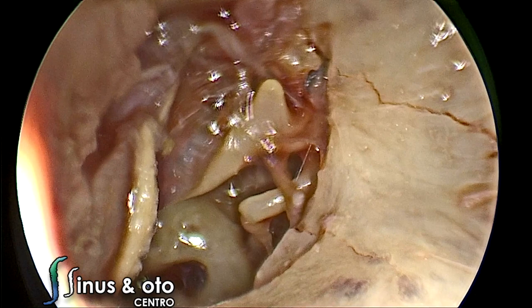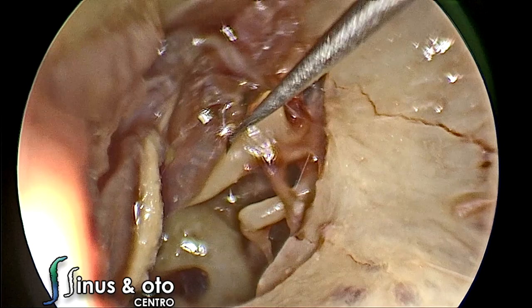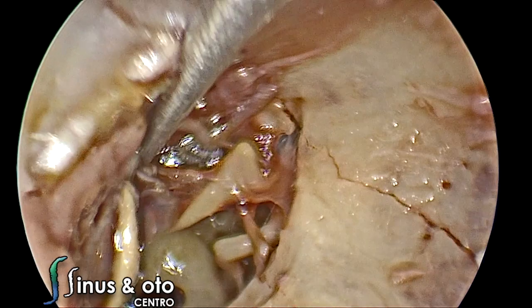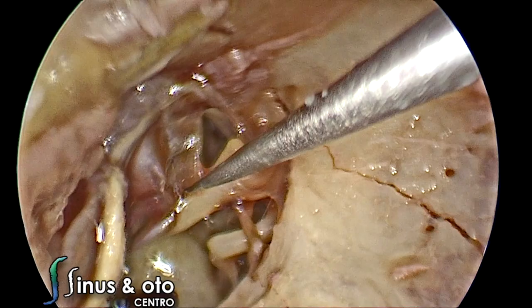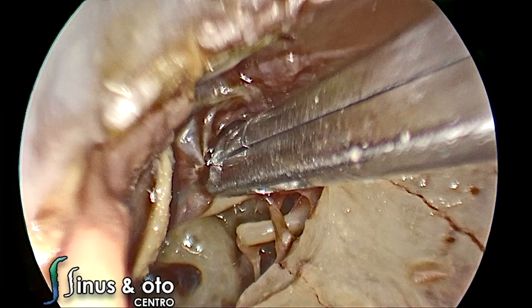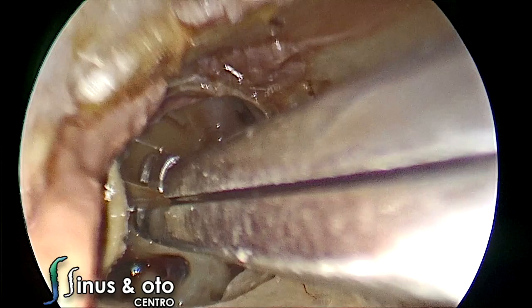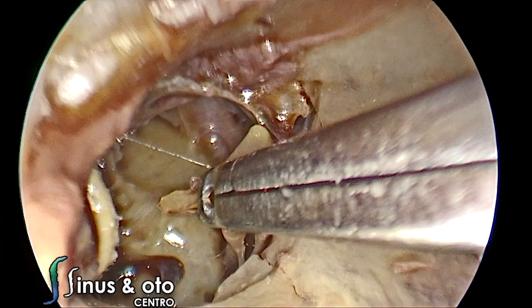There is a very nice dissection plane if you find the malleus cap and dissect the tympanomeatal flap from the malleus. You can use straight instruments to elevate this flap from the malleus. At the umbo, the position is a little more complicated because the layers of the tympanic membrane fuse, creating a very sticky point. You can cut there to expose the tympanic cavity as large as needed.